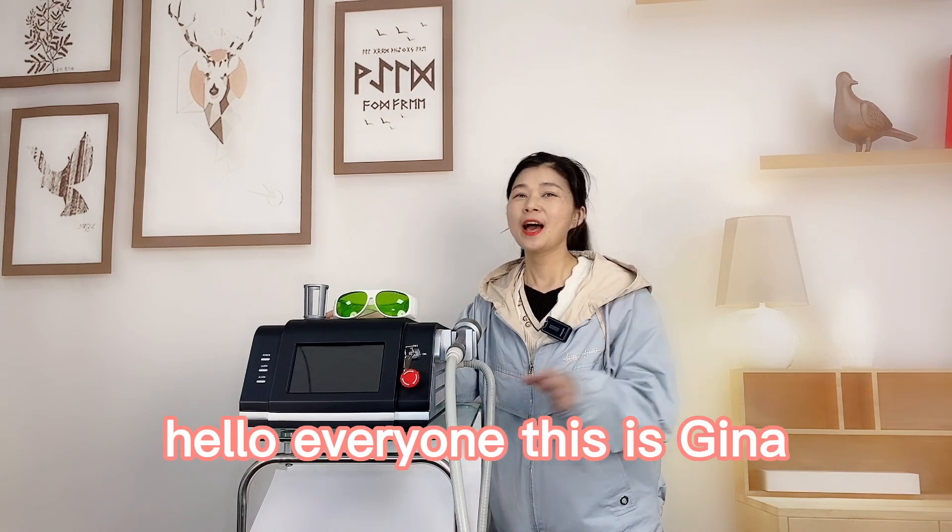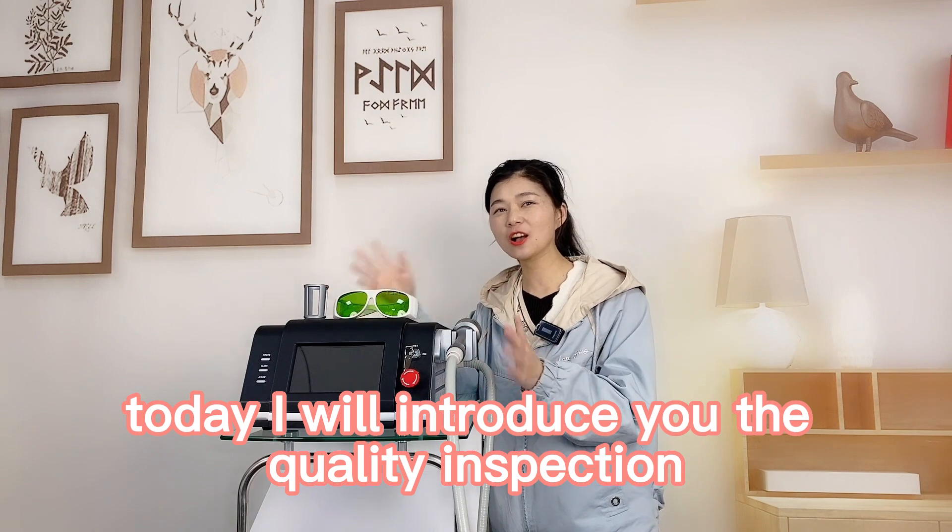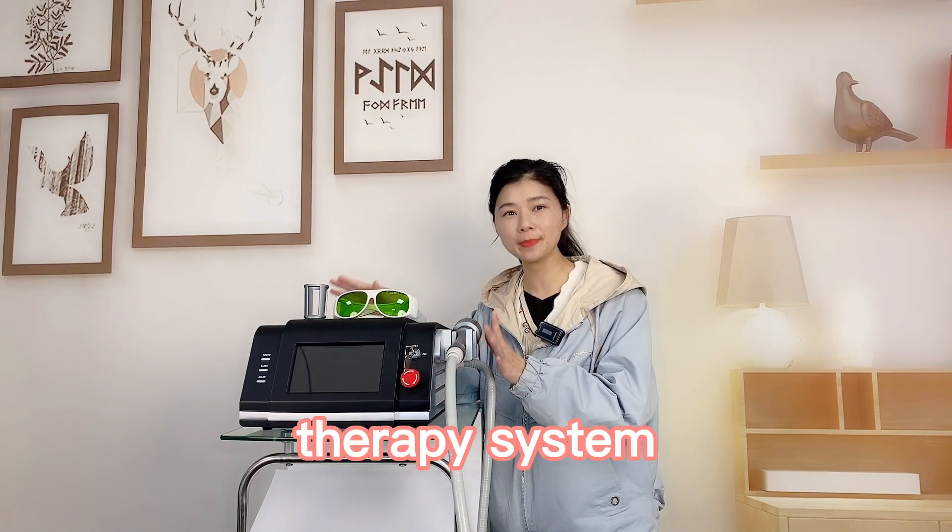Hello everyone, this is Gina. I am very glad to meet you again. Today I will introduce you the quality inspection of the smart laser therapy machine.